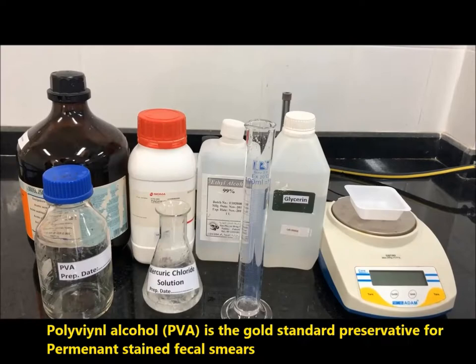Polyvinyl alcohol, PVA, is the gold standard preservative for permanent stained fecal smears.